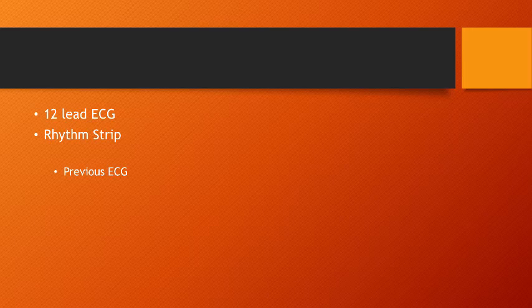For optimal ECG analysis, both a 12-lead ECG and a rhythm strip should be obtained. And the most important thing, comparison with a previous or baseline ECG can be very helpful in these patients. Patients with aberrant conduction at baseline will virtually always have aberrant conduction during supraventricular tachycardia, which we can easily identify when we have a previous ECG available.